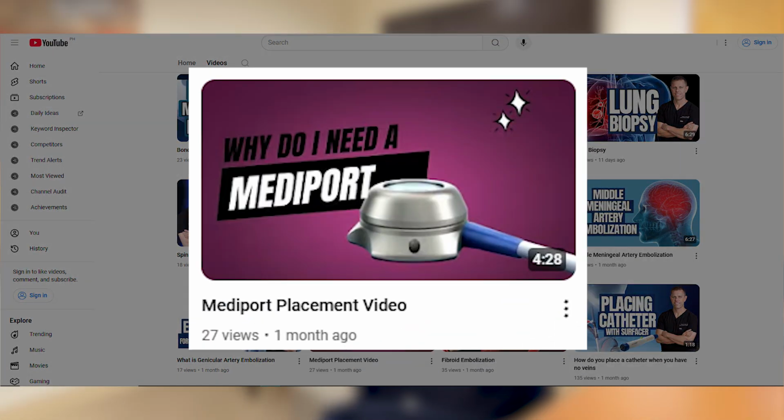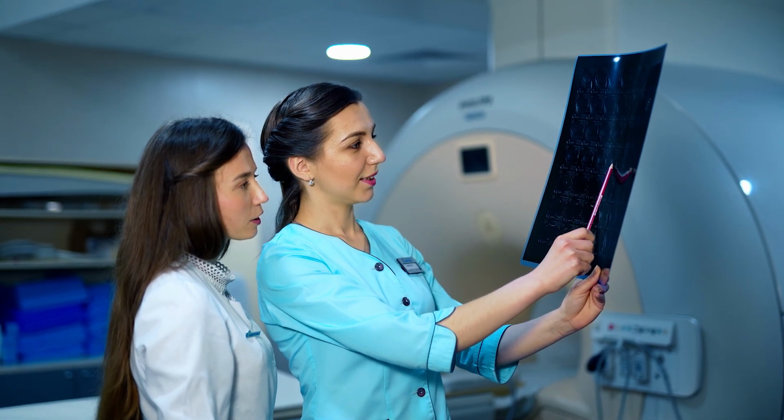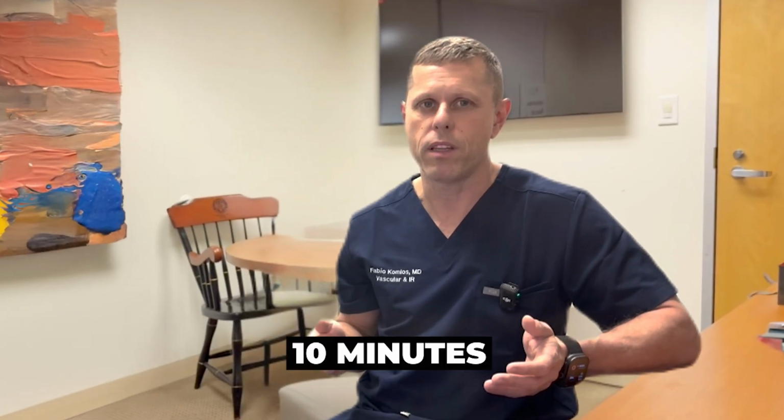So I assume you know what a Mediport is since you have one, but if you don't, you can watch my other video about Mediports. So the first thing when we're gonna remove a Mediport is we wanna make sure that we're on the same page with your oncologist and we are all sure that you won't need this device again. The procedure is really simple. We do this in the office just with local anesthesia, so it's very convenient and you can drive yourself to the procedure and drive yourself home.